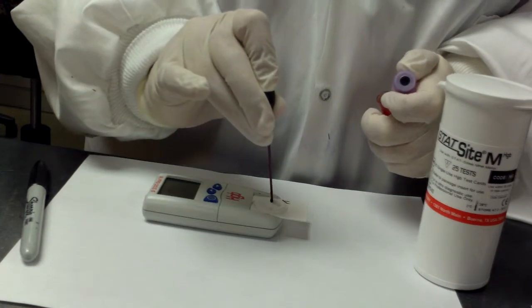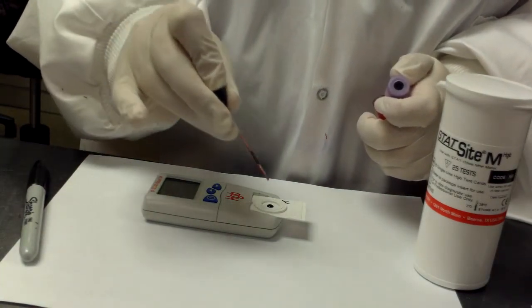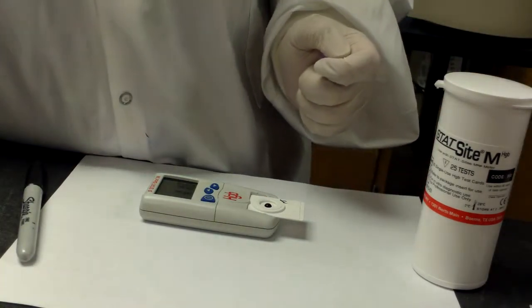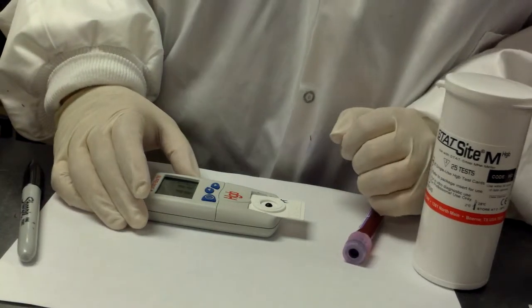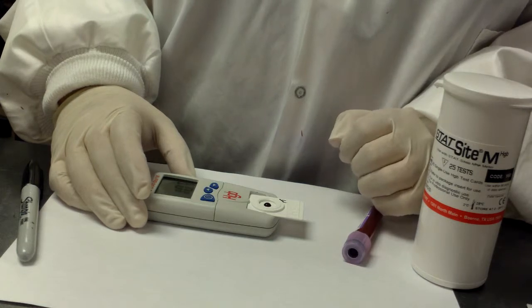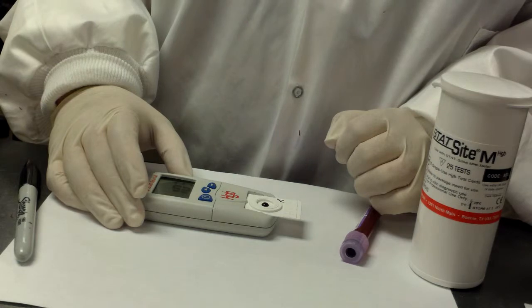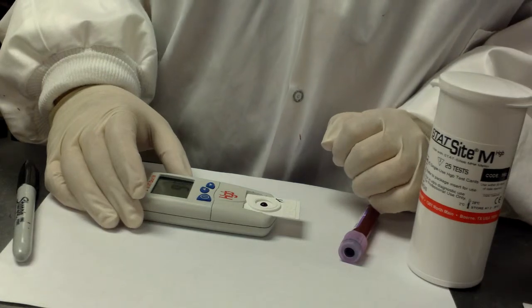And once you have enough on there, it will begin a countdown for 118 seconds. I'm going to throw our capillary tube in the sharps container. And 118 seconds is a really, really long time when you're waiting for the result.